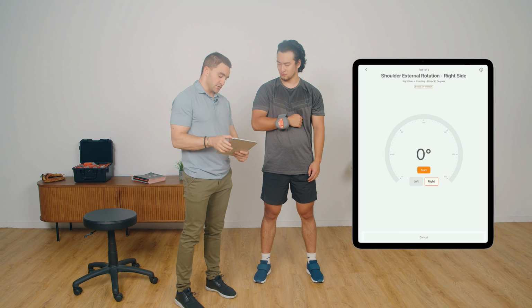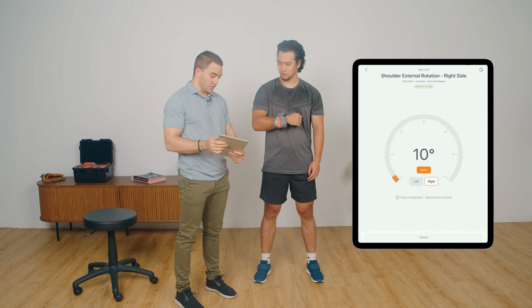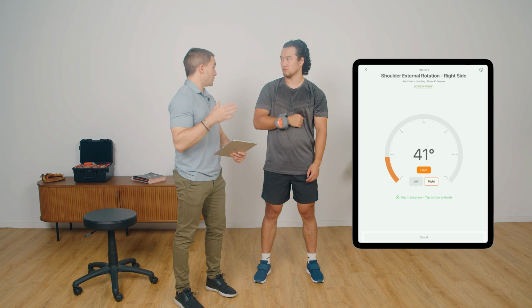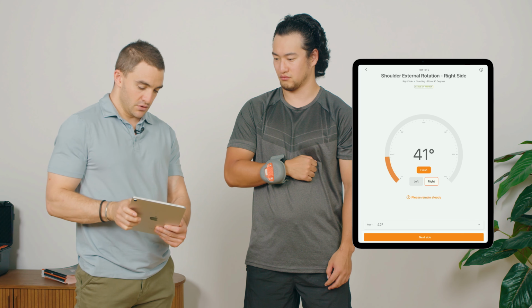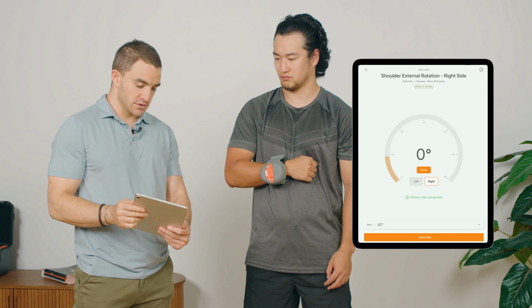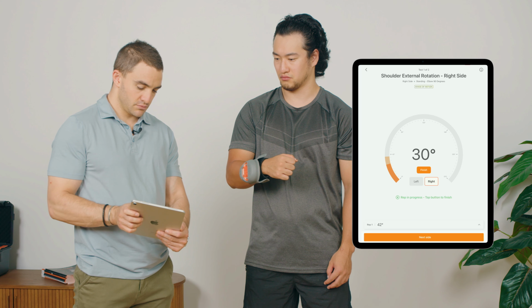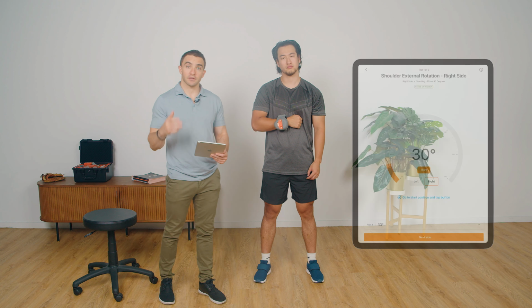So Cal, you're only allowed to externally rotate to 30 degrees for the next few weeks. So let's see what that looks like. When I click start, hold nice and steady. When it says go, go ahead and move until this says 30 degrees. Perfect. You went a little bit over. Go ahead and go back. That's what the feedback is for. It's hard for you as a patient to understand what 30 degrees feels like, so that's why we use this. Let's try that one more time. When you're ready, just nice and slow to 30 degrees. Perfect. And go back.